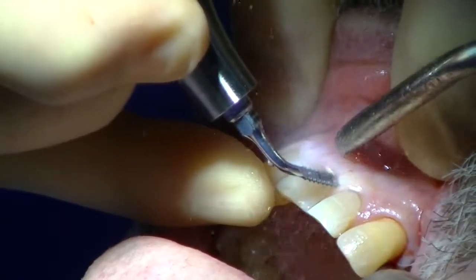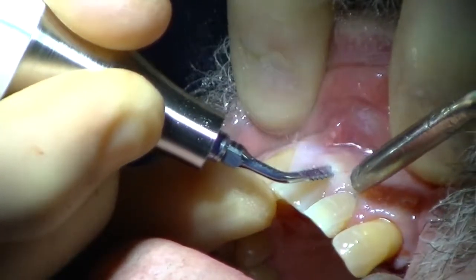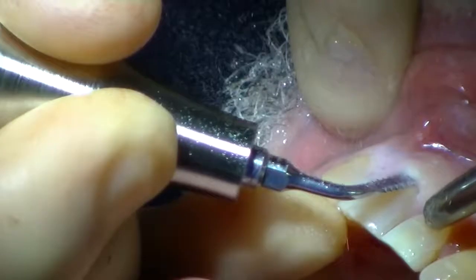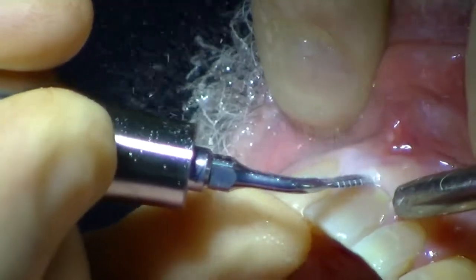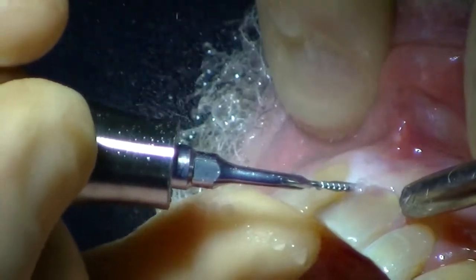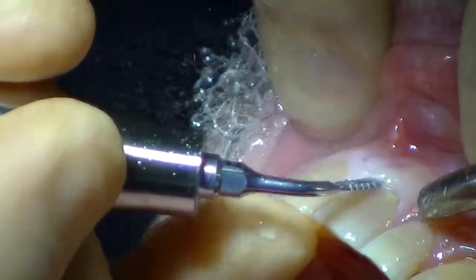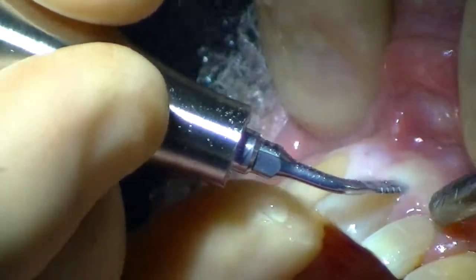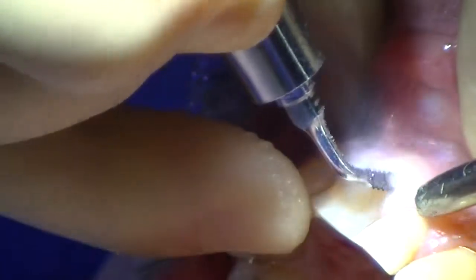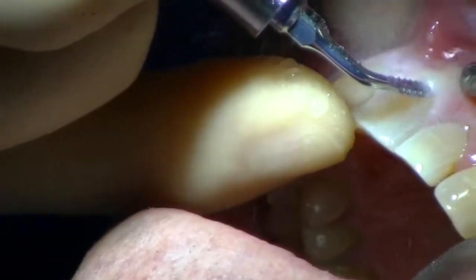And what I'm doing is a lot of water, and I'm simply going around the tooth, kind of soft. You certainly don't have the power to do this with just a periotome, and you can see how deep I'm able to go very efficiently.